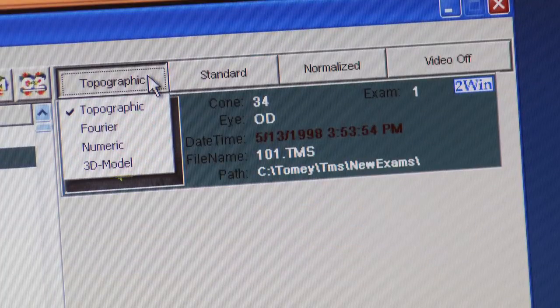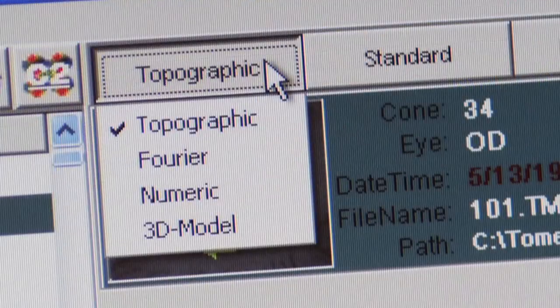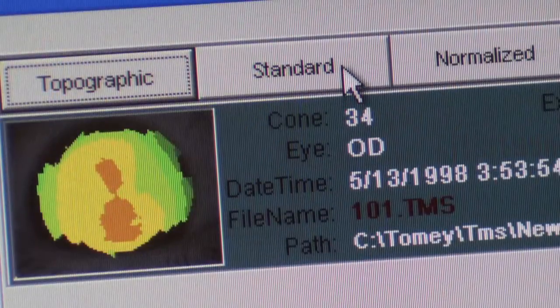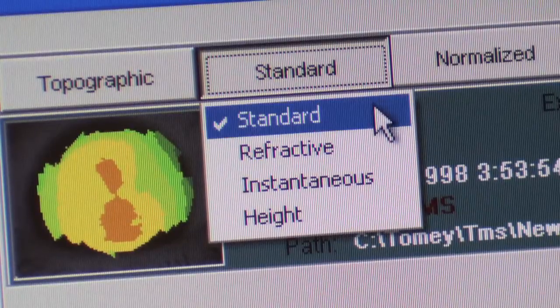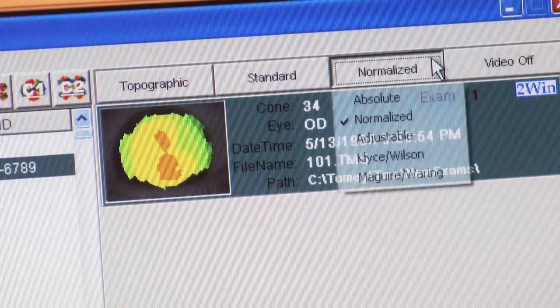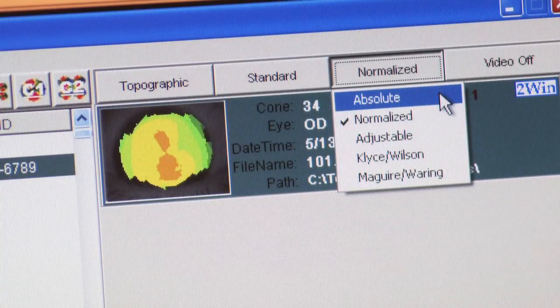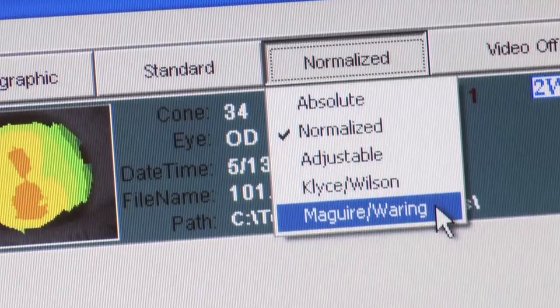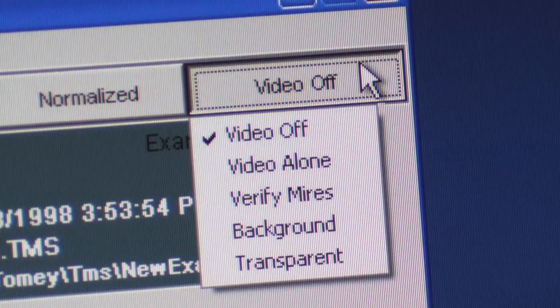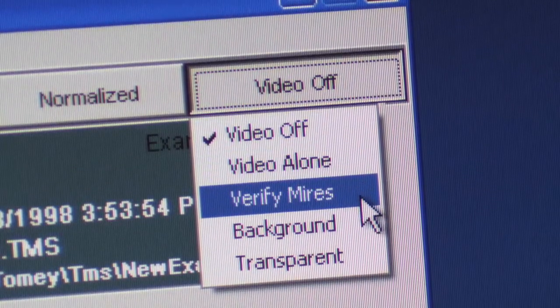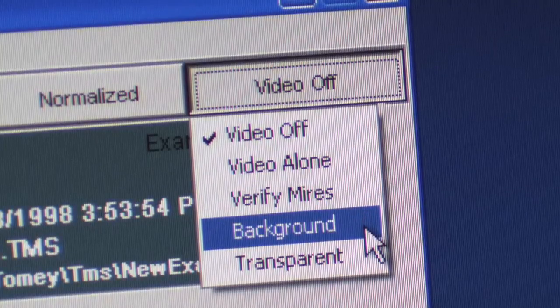There are four action pull-down menus. The first allows you to select from four different types of displays: Topographic, Fourier, Numeric, and 3D model. The second menu offers Standard, Refractive, Instantaneous, and Height displays. The third has five selections: Absolute, Normalize, Adjustable, Klyce/Wilson, and Maguire/Waring. The last pull-down menu allows you to select from background options: Video Off, Video Alone, Verify Mires, Background, and Transparent.